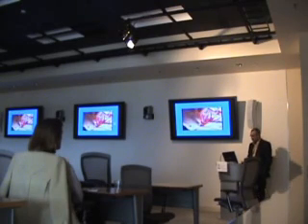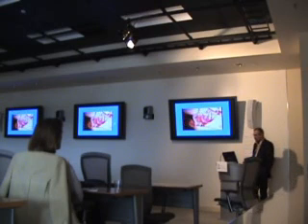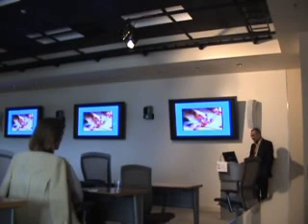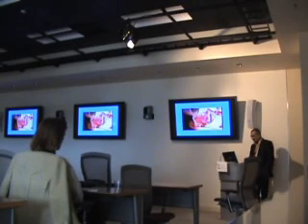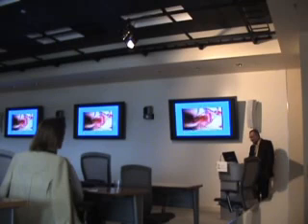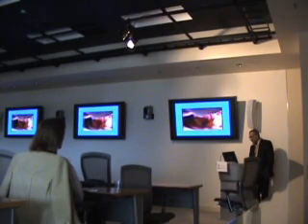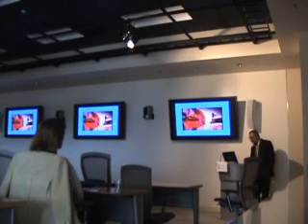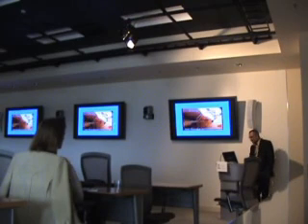So we experience all the actions that happen during live surgery, which makes it different from other training models and other simulation. So making the incision in the carotid artery, and you can see the bleeding as if in a live patient. I believe anybody who sees this without knowing this is a cadaver may not tell the difference.